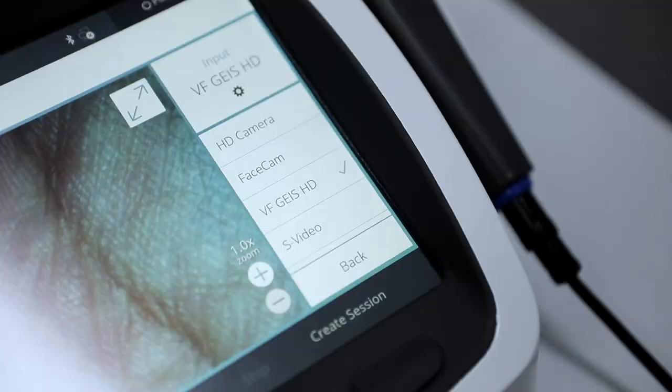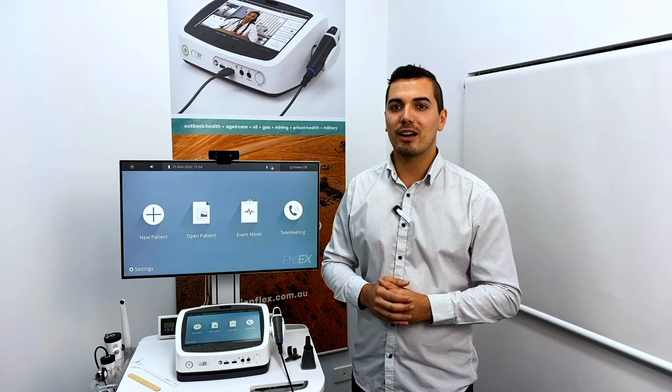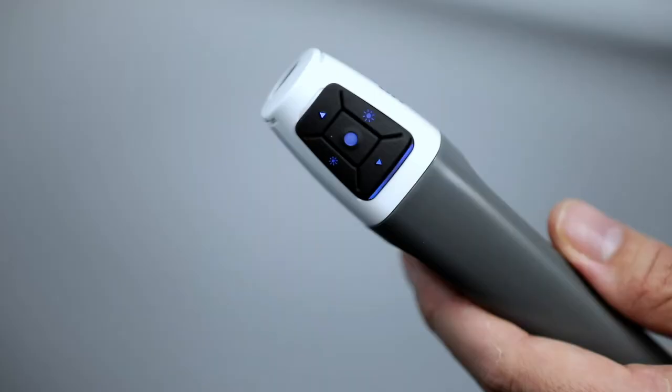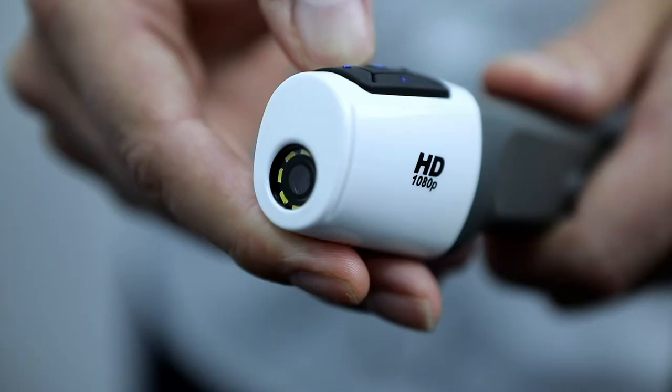Alternatively, you can refresh the input by holding the input button down on the Pro EX screen for five seconds until you hear a single beeping noise. You can also change the brightness of the LED lights by pushing the two light symbol buttons on the left and right sides of the camera.